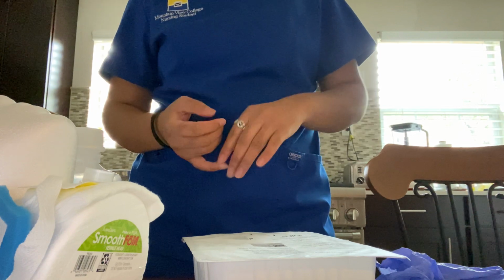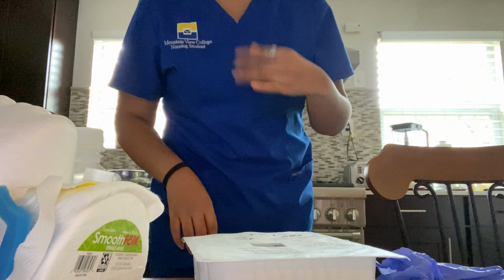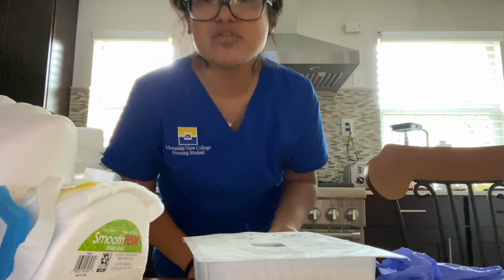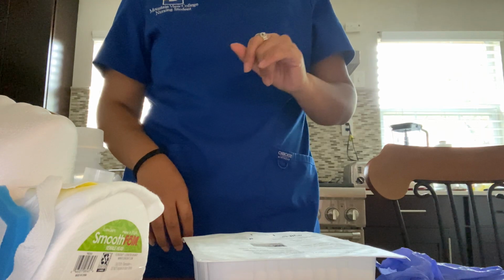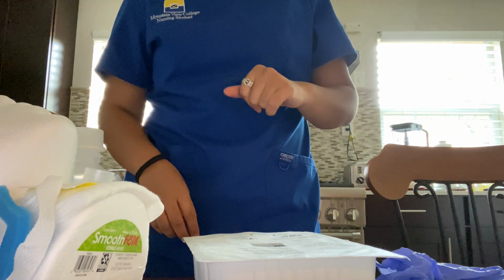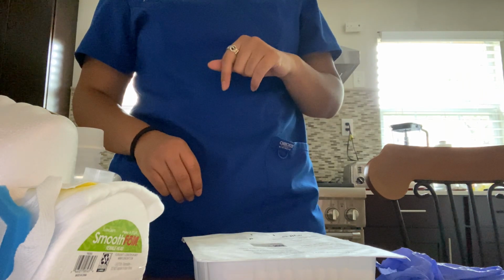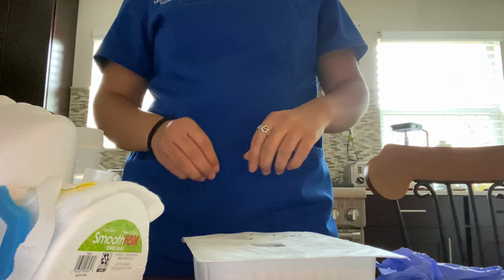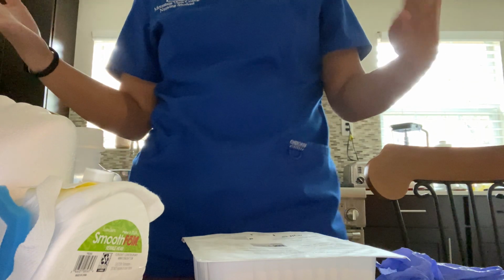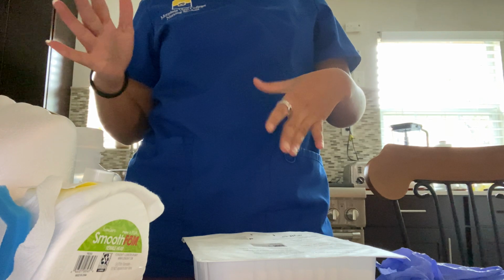Okay, so to suction, you have to have the right amount of suction. You have to set it to 100 or 120, because if it is too high, it can cause tissue damage, and if it's too low, it won't work effectively. So you're going to make sure that your suction is always set correctly, and that if they're connected to oxygen, it is working. You have to verify that you have good suction, and then you're good to go. You want to make sure that the bed is raised and the patient is put in a high Fowler's position. That is very important.